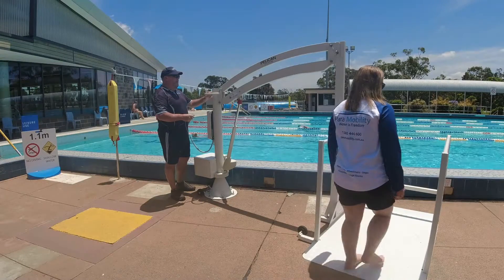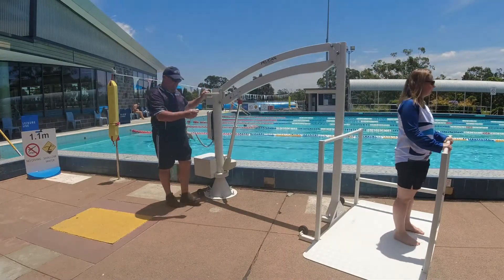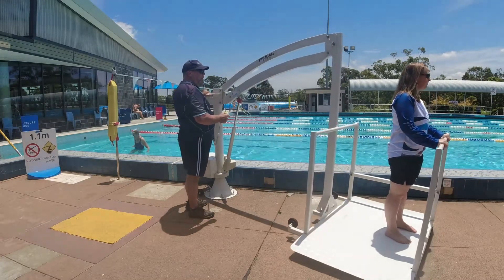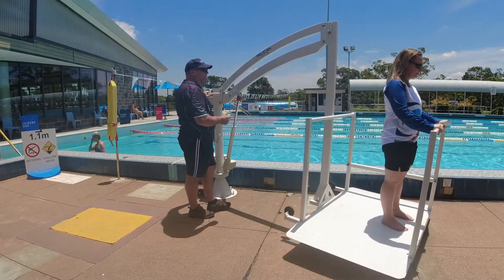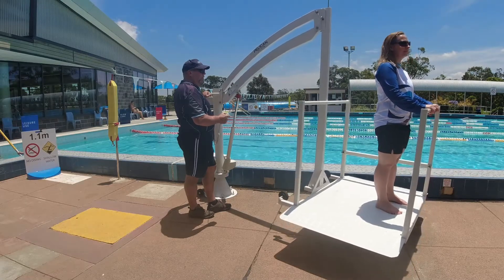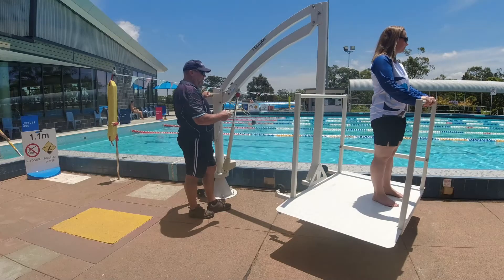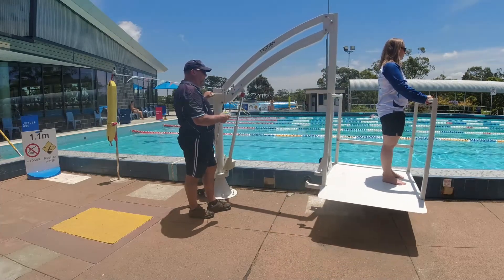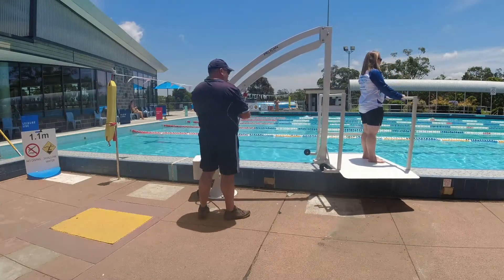Now it's time to use the platform and we see two differing ways. The first is for a person that is mobile and well balanced, where they use the platform as a means of safe entry and exit without the need for other equipment. Often a person can enter a pool due to momentum, however exit is a challenge as momentum is against them. The platform has solid fixings and structural design with no swing motion, so all movement is through the power rotation and at low speed.